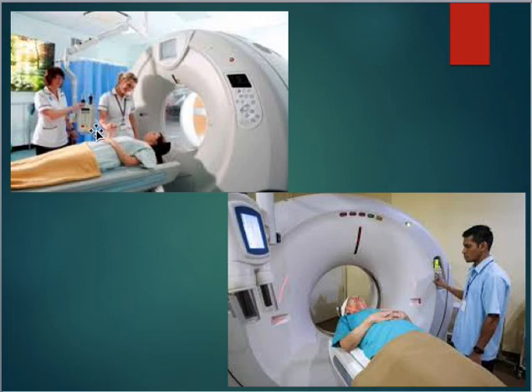This one here that this lady has, this is what we call a power injector. So we do use contrast. We'll talk about that a little bit later. If we're using IV contrast, we don't want to be in the room when we're injecting the contrast because then we're subjected to the radiation. But we need to give the contrast at an adequate time so that we can still take the image and visualize it. If we went into the room, injected the contrast, walked out and started scanning, the contrast would already be out of the area of interest.